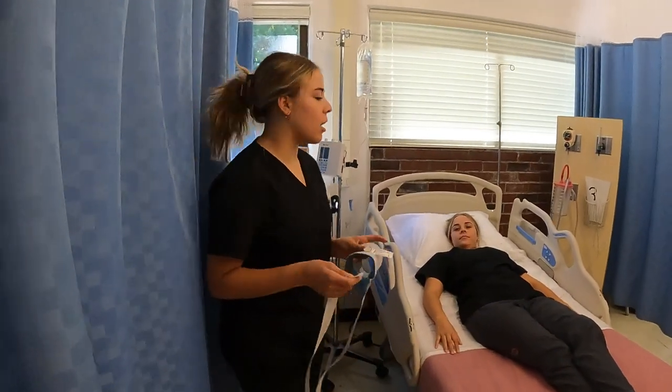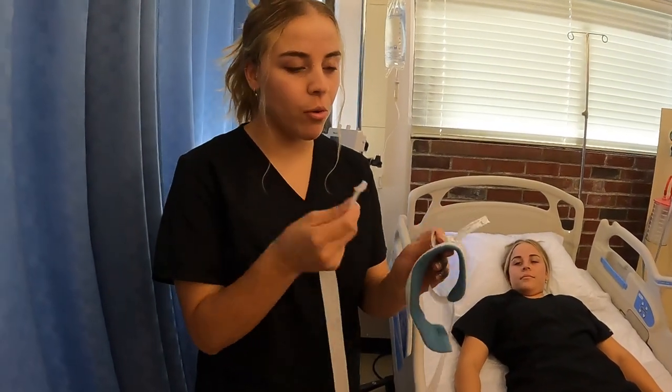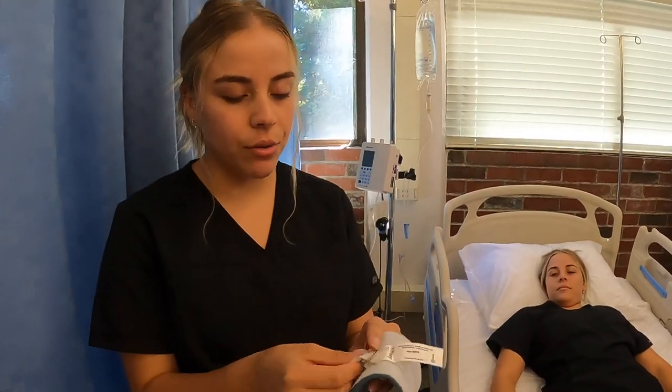So before we put restraints on the patient, we want to make sure that this is prepped before, so I'm just gonna put the string through the loop.